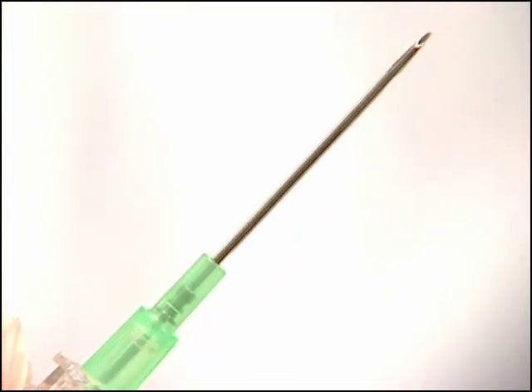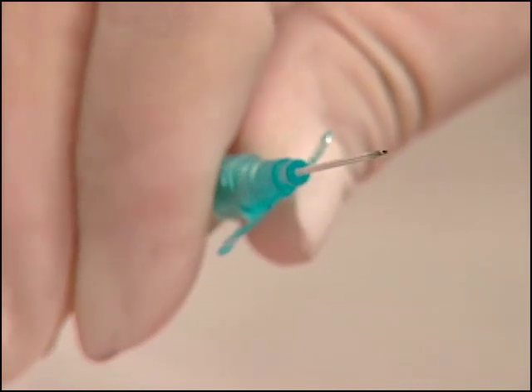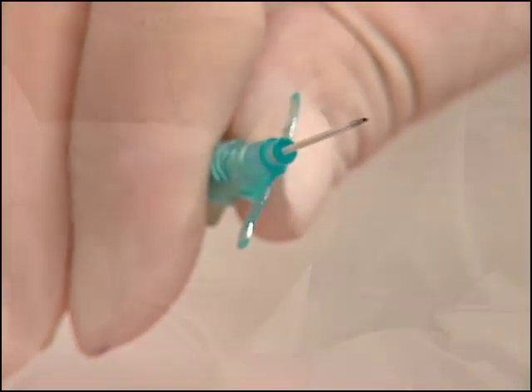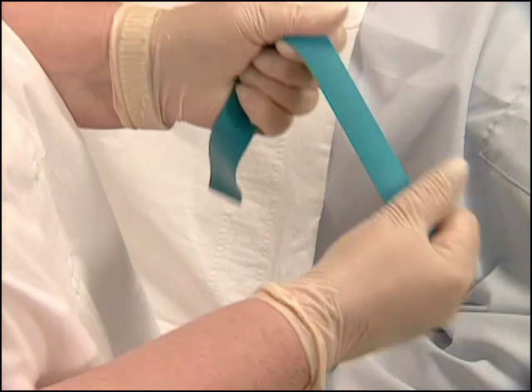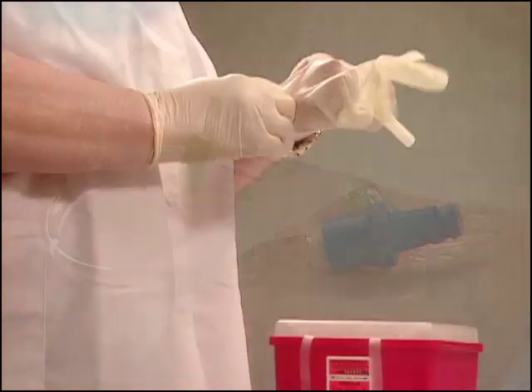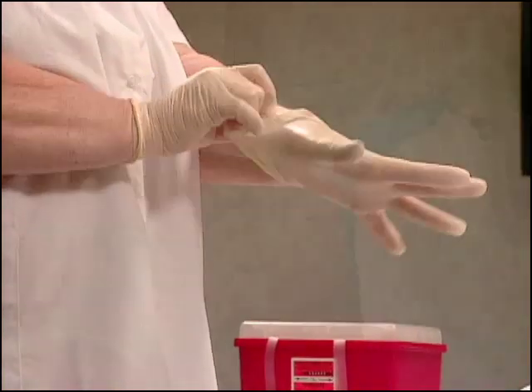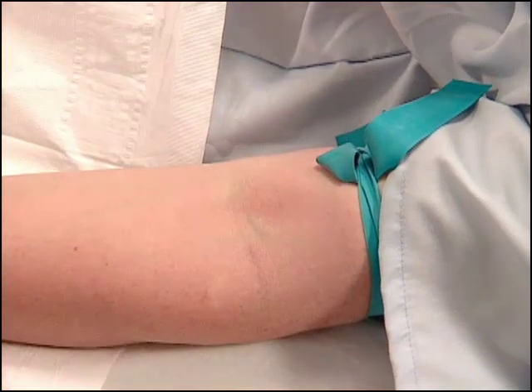Catheter insertion into a vein is generally done for one of three reasons: to replace fluids, to give medications, and to repetitively draw blood for testing purposes. Practitioners should be aware of local protocols and follow them at all times.